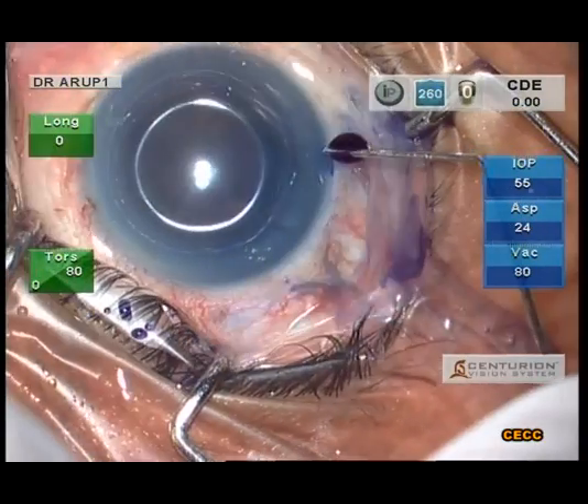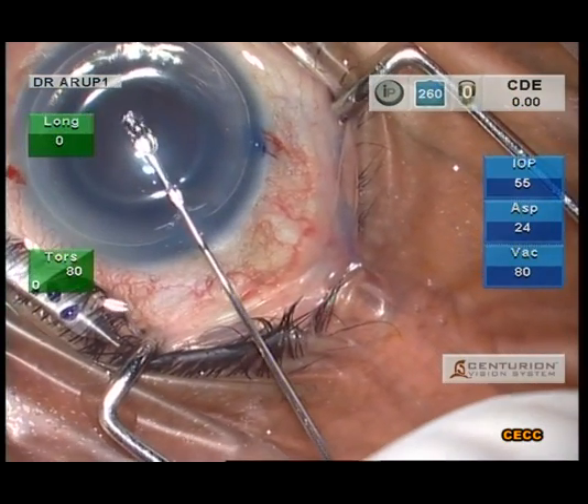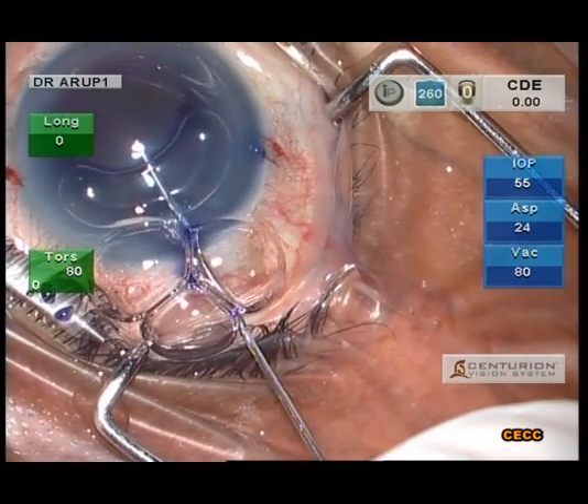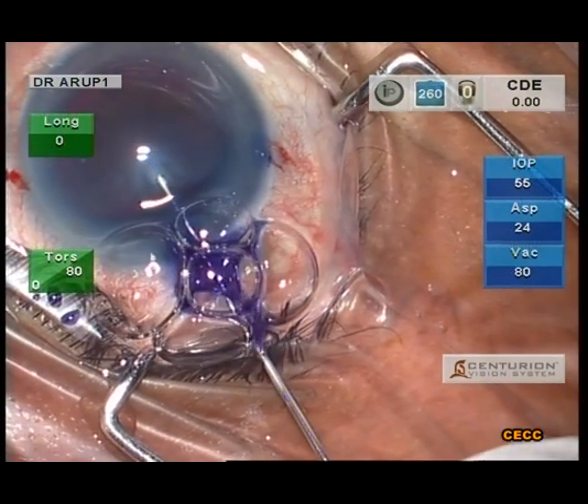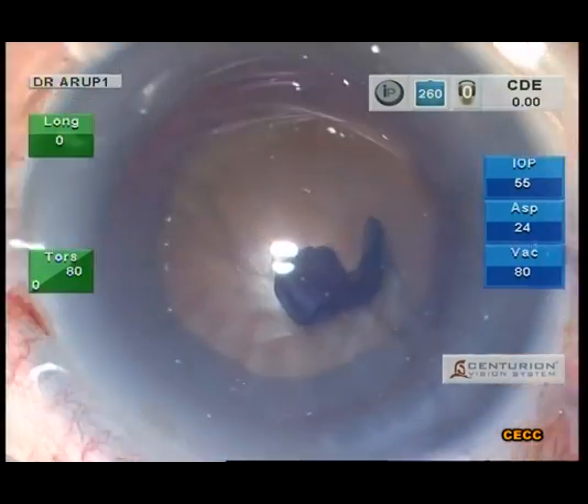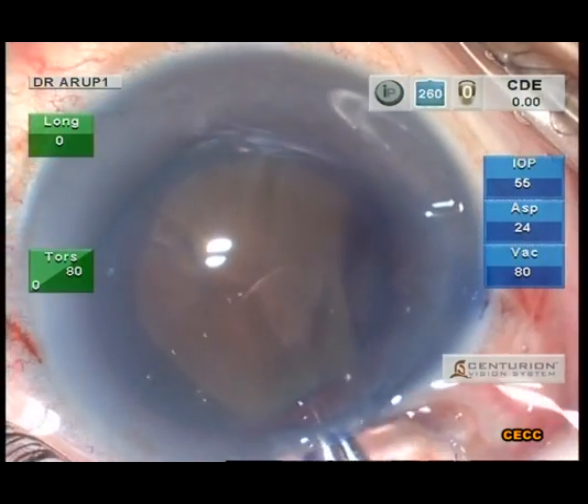The rexis should never be small in hard cataracts. A small rexis has a higher chance of capsular blowout and harbors a greater potential of iatrogenic capsular trauma during phaco manipulations, especially in the hands of a beginner.